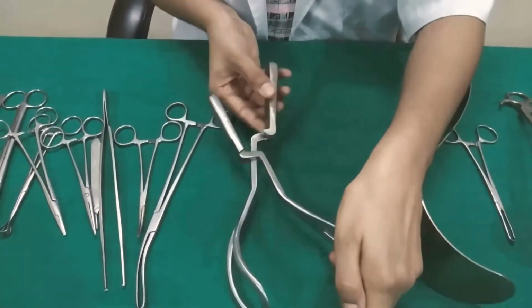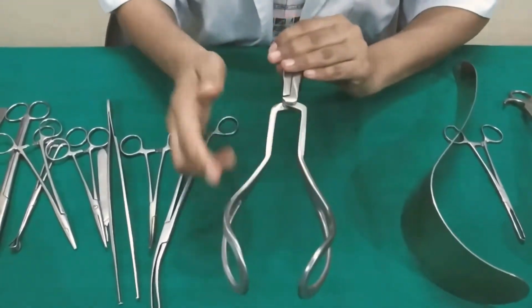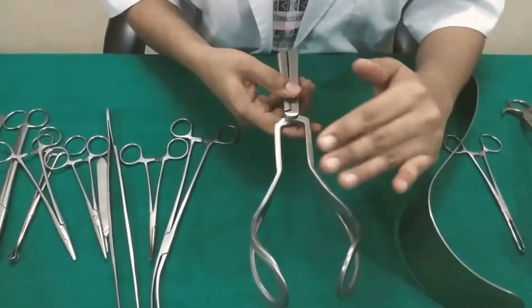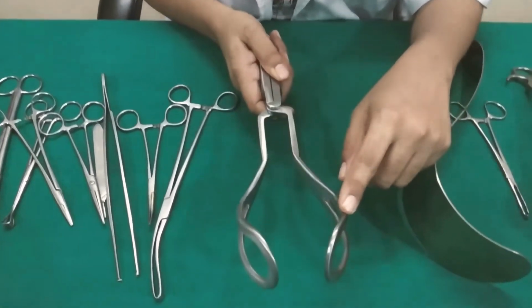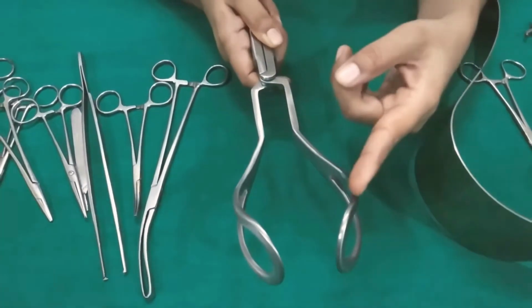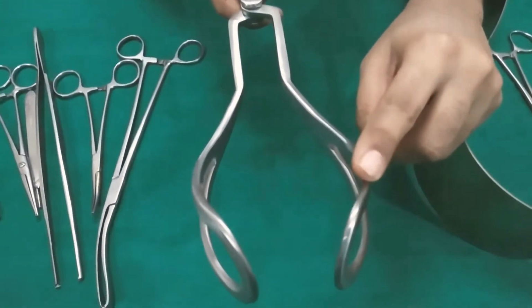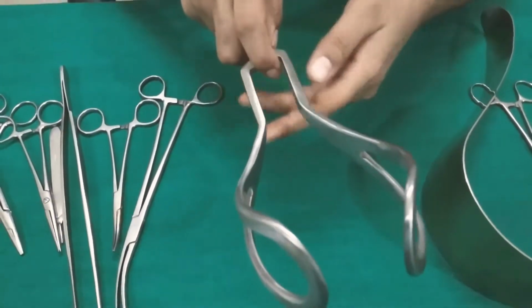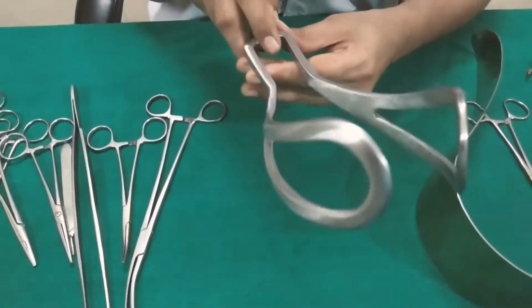When we apply the blade correctly, the blade should articulate in an easy manner. Then the third step is the traction, and the fourth is the removal. For giving the traction, we grip the handle, placing the middle finger in between the shank and the right and index finger either side of the finger guard.